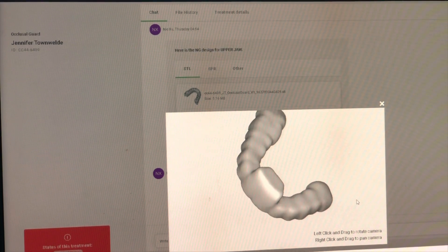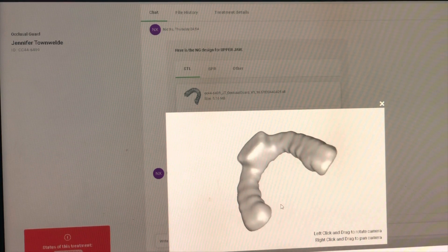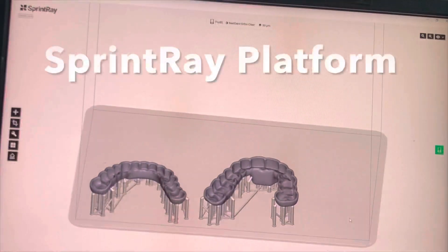Here's the design. So they made this as a B-splint that we're making on this particular case. You can see that they send that design back, and then we can put this right into the Sprint Ray printer and start to organize it.